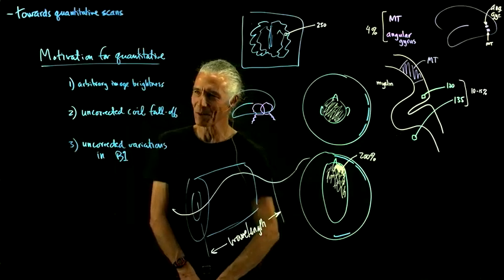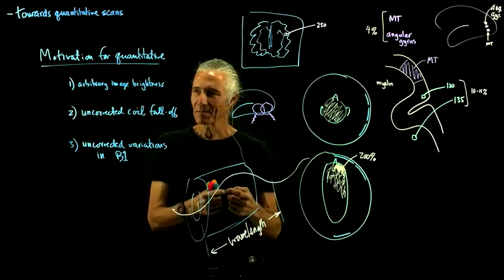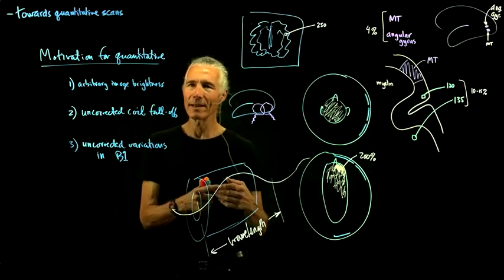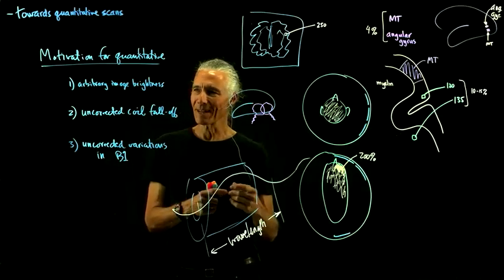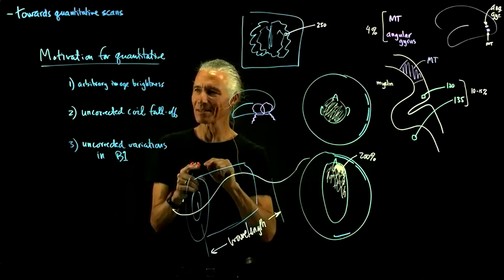What is the frequency of a microwave? The frequency here was about 63 megahertz. Our 3 Tesla is about 123 megahertz. Your microwave is 2.4 gigahertz, so that's 2,000 megahertz. So what happens in the microwave? You get hot spots. You stick something in there, something gets really hot, and something else isn't as hot.